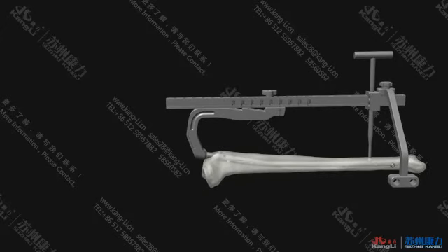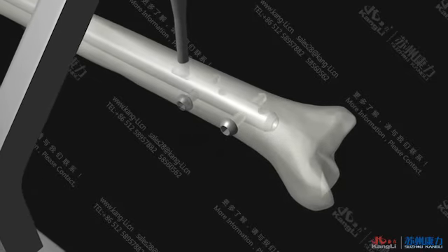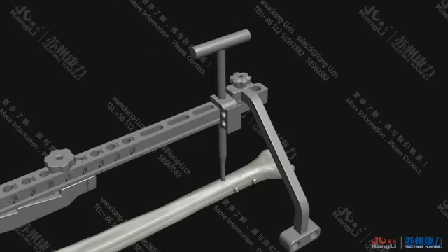If the fluoroscopy is not available, insert the ball guide pin along the central hole at the end of the holder until it passes through the center of the nail of KTO Tibial intramedullary nailing system and reaches the distal end to detect if the locking screw is at the locked status. Repeat the steps described above to finish the placement of the second locking screw. Remove the distal targeting bracket.